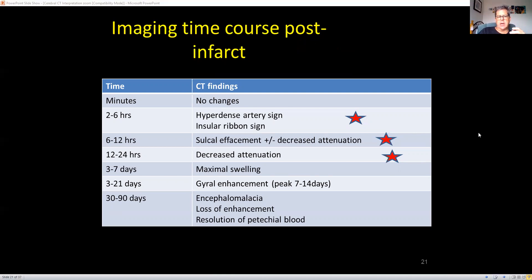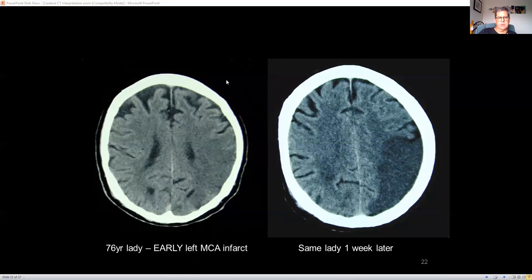Most of the changes you see on CT take a while to occur as edema increases. At six to twelve hours it starts to appear, with maximum swelling at three to seven days. After that peak, it then resolves into encephalomalacia. Here's the same person with two different CT scans. You can see very early on from a left middle cerebral artery infarct, there's edema with loss of sulci. One week later it's really delineated — still some edema around the area — and after that the fluid resolves leaving encephalomalacia.